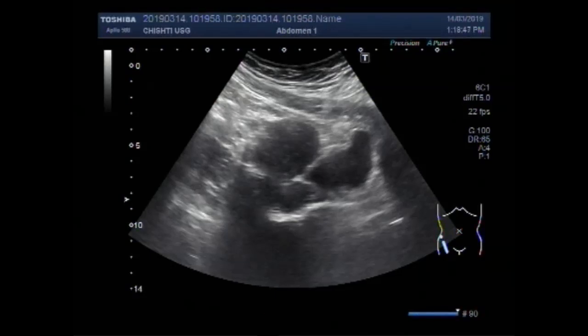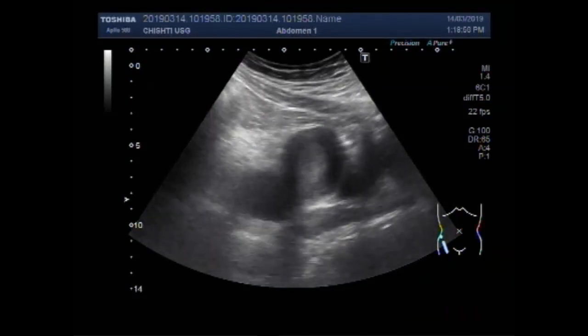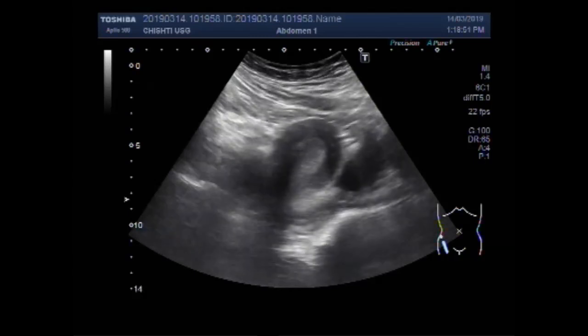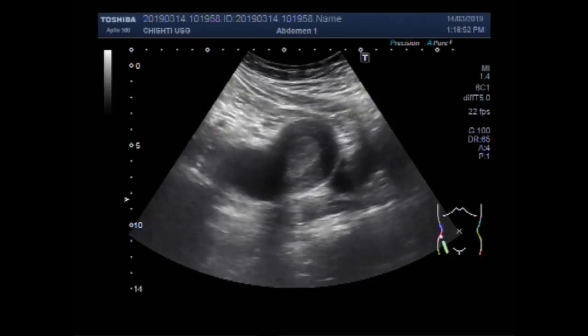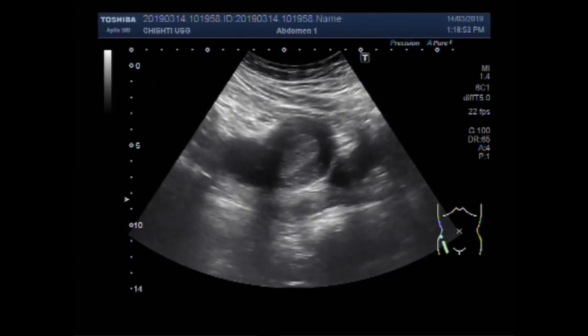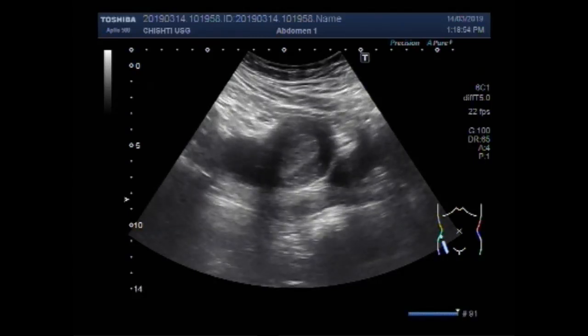Dear viewers, I hope you are all fine. This ultrasound video shows a uterine polyp with an ovarian cyst.